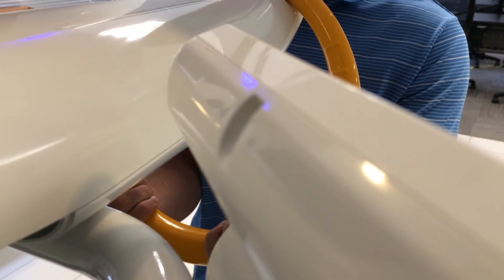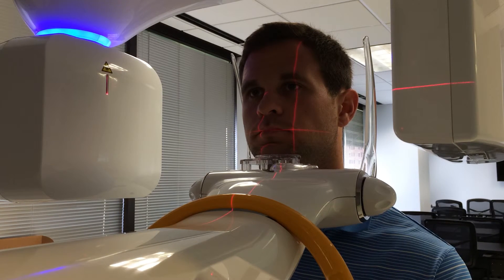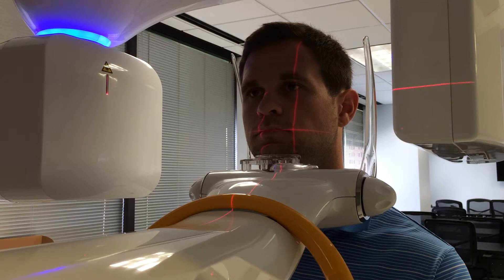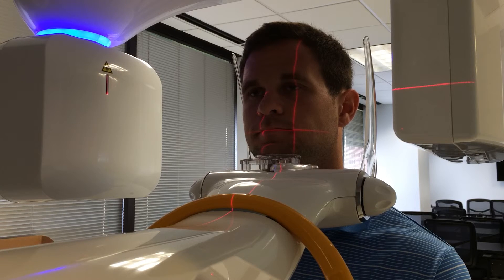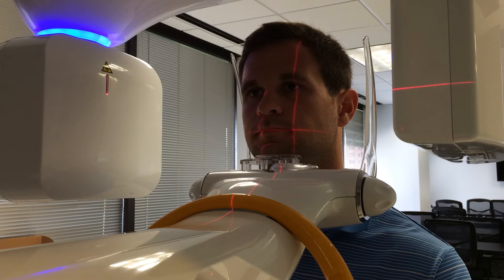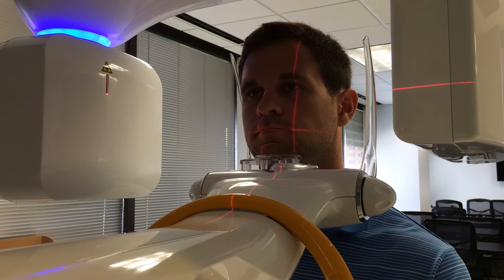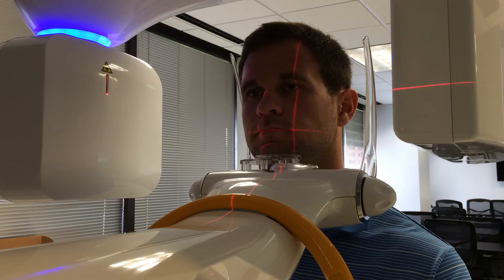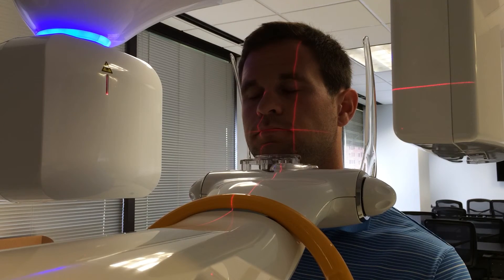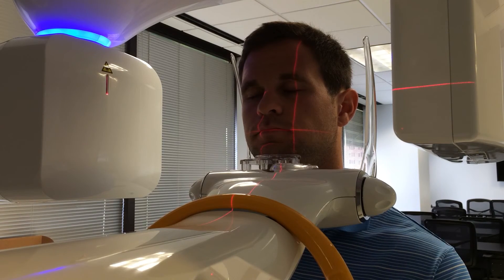You'll notice we have our positioning lasers on, and the only one we're going to pay attention to is the mid-sagittal plane laser. But rather than being in the mid-sagittal plane, we actually want that to go to the left of the patient's left eye, which is going to help us line up to make sure that the patient's TM joint is going to be in the field of view. Now that we have the patient offset to his right so his left joint is centered into the image, and oftentimes the patient will be pressing against the right temple support to give themselves some stability, we'll press ready on the remote or the touchscreen or the computer screen to ready the machine and then complete the acquisition.